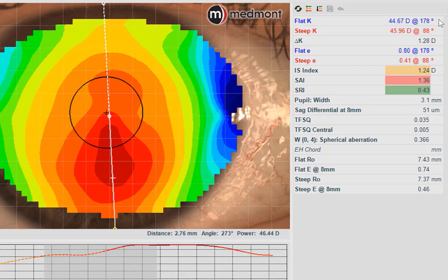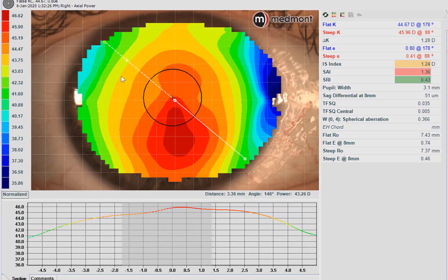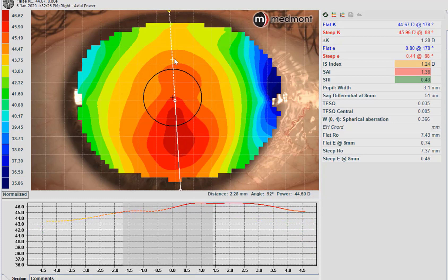The K readings tell us it's a slightly steeper cornea. The corneal astigmatism is moderate. The eccentricity has gone up over our previous case — we have a 0.8 eccentricity. Generally, the threshold where we see keratoconus developing is around 0.8 or higher, and this patient is certainly teasing that threshold. The SAG differential has also gone up significantly: there is a 51 micron height difference between the flat meridian and the steep meridian, telling us the peripheral cornea is relatively toric even though the central corneal astigmatism is fairly mild.